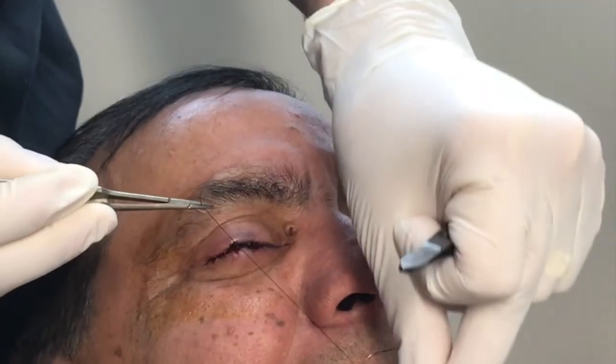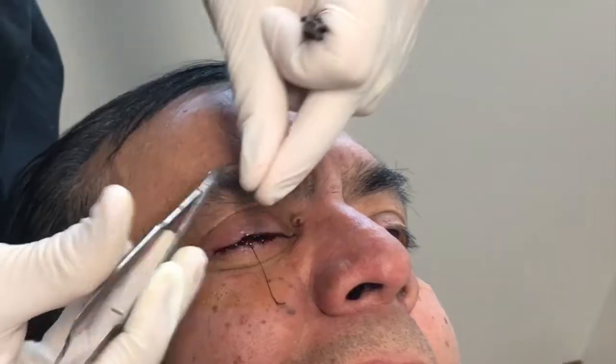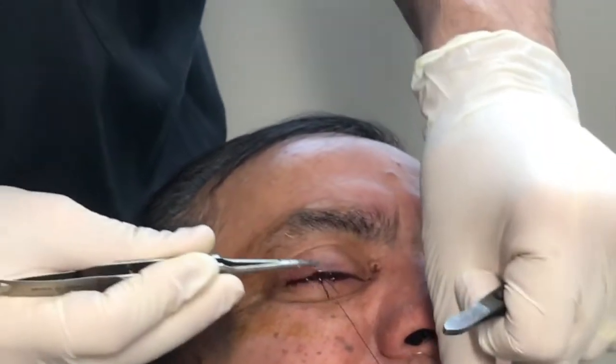Several square knots are being shown, and then you can leave about an inch of suture to make it easier to remove in a couple of weeks. It can be repeated.